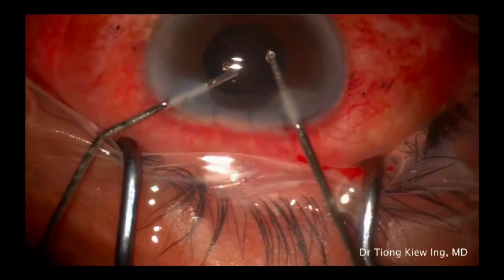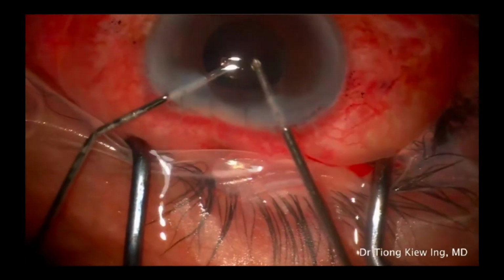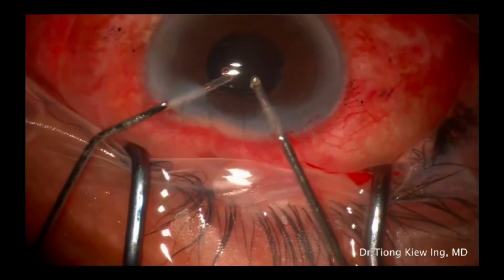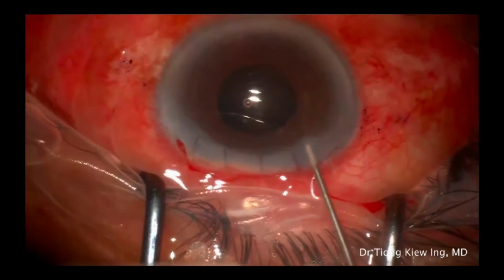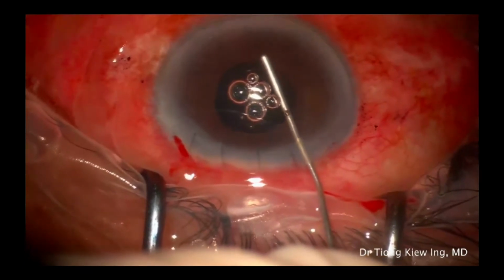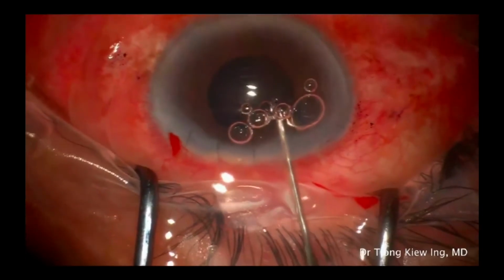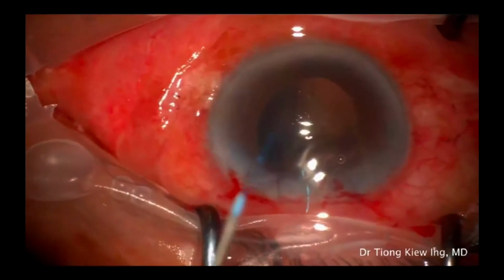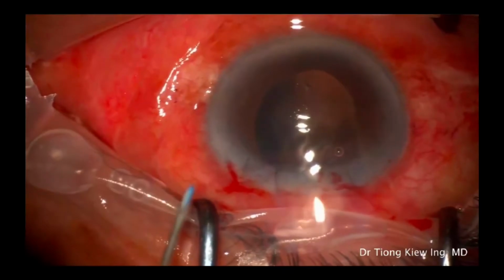Anterior vitrectomy is then performed to remove any residual vitreous in the anterior chamber. Subsequently, ophthalmic viscosurgical device (OVD) is injected into the anterior chamber. A 27-gauge needle with preloaded Prolene 5/0 suture is checked properly to ensure suture in place.